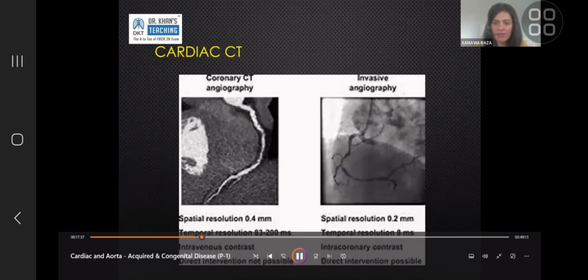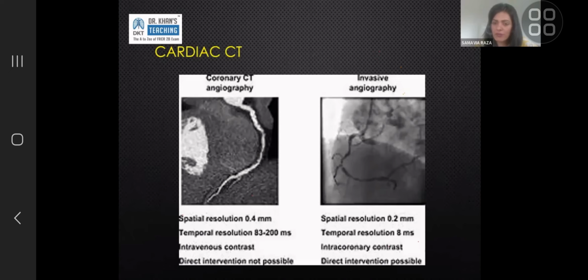So that is true for USA, that is true for England, that is true for most of the world. So cardiac CT has revolutionized how we do the diagnostic part of the coronary imaging. It will give you detail almost as good as invasive angiogram, and it will give you what invasive angiogram will never give you, which is information about what that narrowing is.